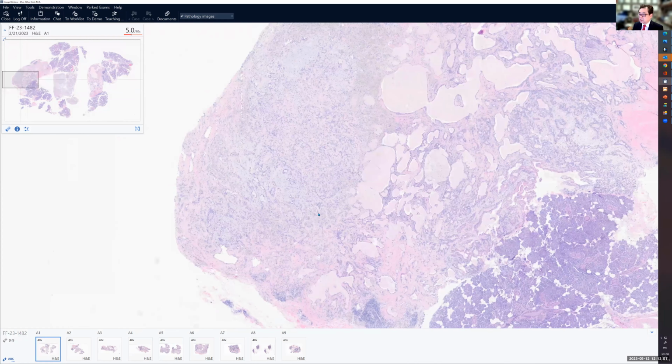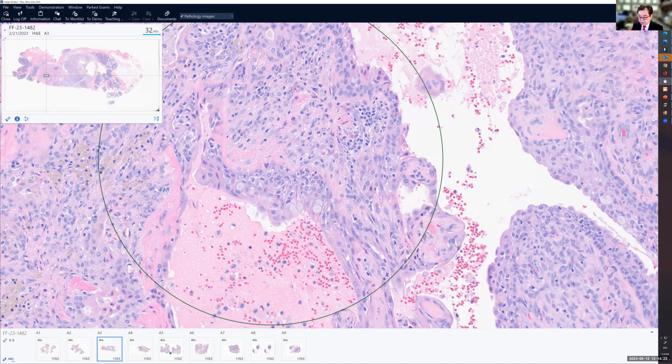And some areas make me think about oncocytes here, and mucocytes, right? And more areas here. So very nice mucocytes here, and cystic mucocytes. So clearly you have to think about mucoepidermal carcinoma, right? However, you have to go low power. Look at the low power.